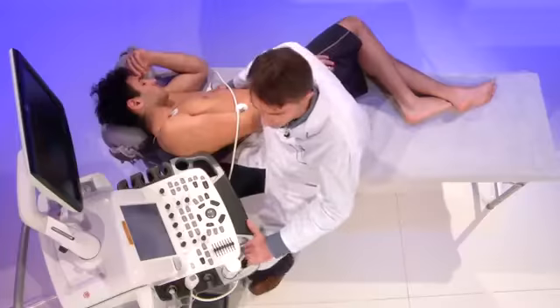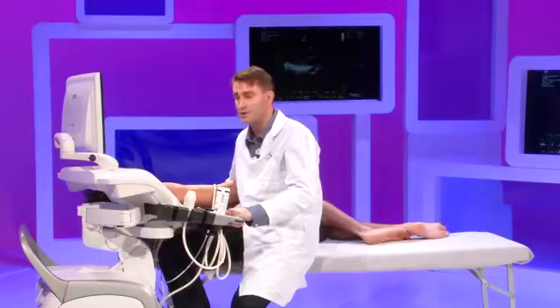One last remark before starting. Ultrasound machines need maintenance. If you have a machine which is more than 10 years old, the probe is worn down and your echo quality cannot be optimal. So at least once a year you need to maintain your echo machine.